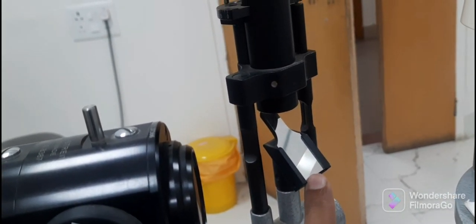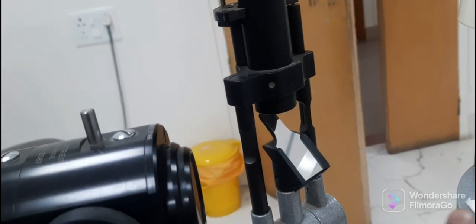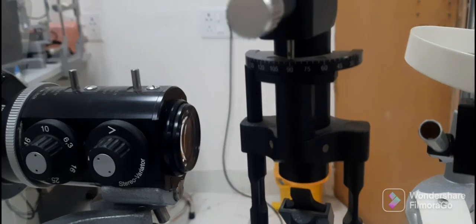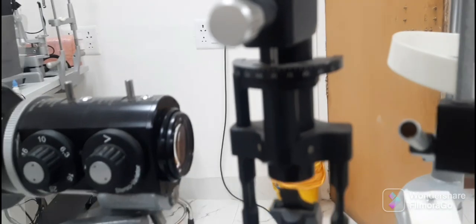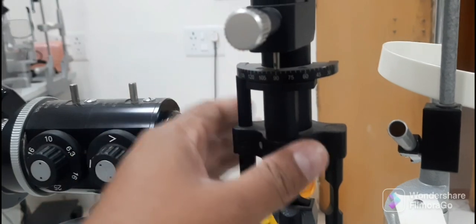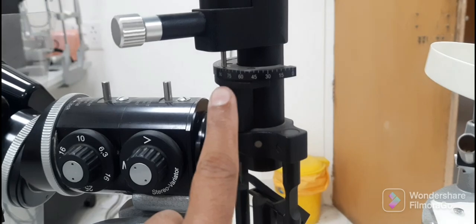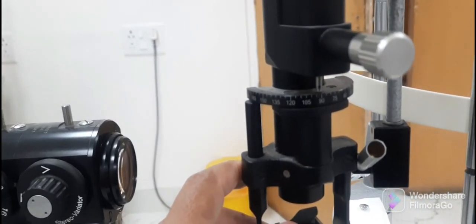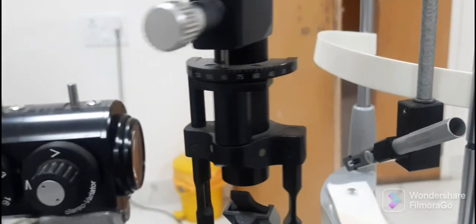This is the reflecting mirror through which the light passes and goes to the patient's eye to illuminate it. Just above the reflecting mirror, there is one more scale showing angles from 0 to 180 degrees, used to rotate the direction of the slit during different types of illumination.